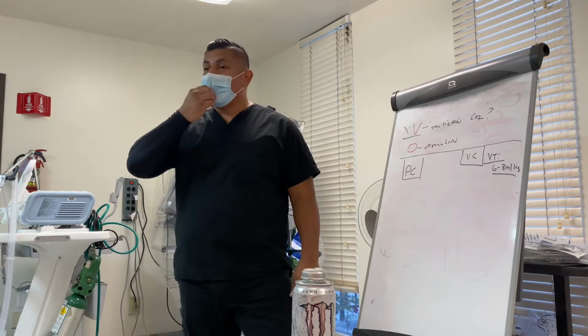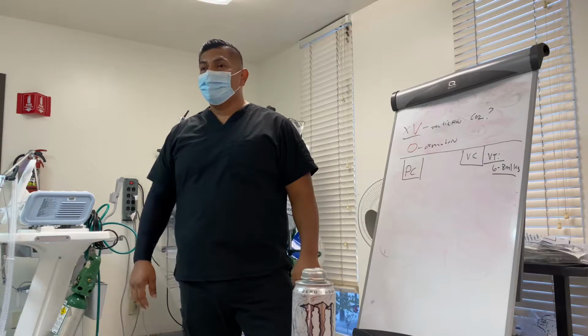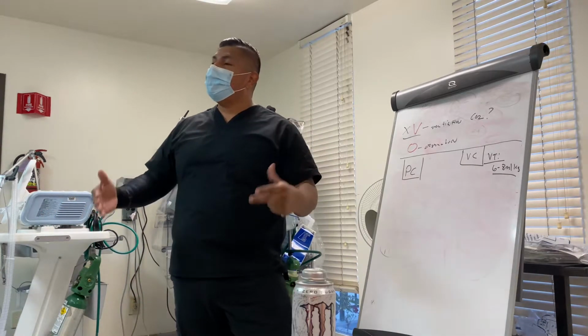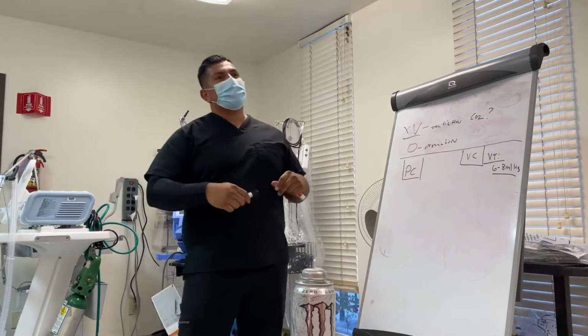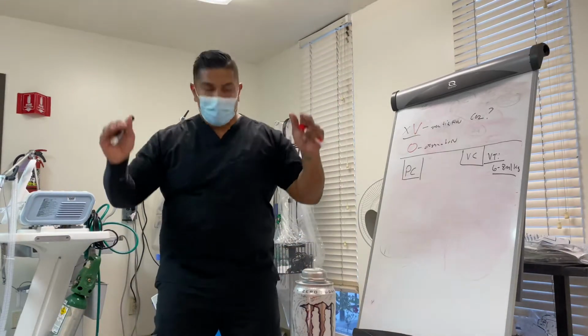But you as respiratory therapists know you can't do that. Plateau pressures are really high, peak pressures are really high, PF ratio is really low. You're going to be damaging these patients even more. So what do we do? Well, what did we do with Dave earlier on today? Take a deep breath and hold.